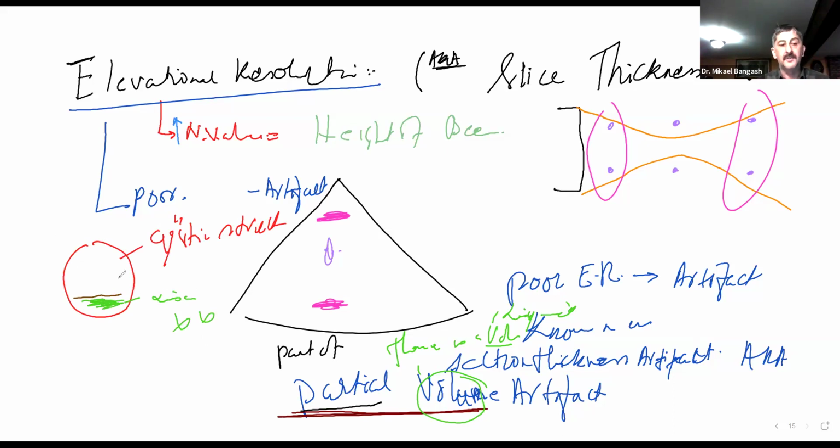It may be an empty cystic structure, just a cavity or something like that. What looks like fluid here is an artifact caused by poor elevation resolution.